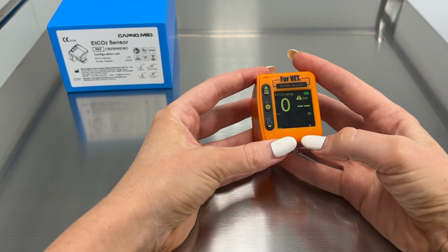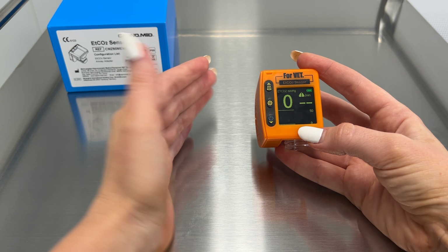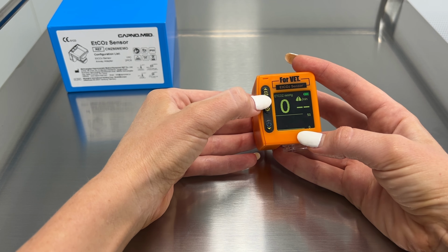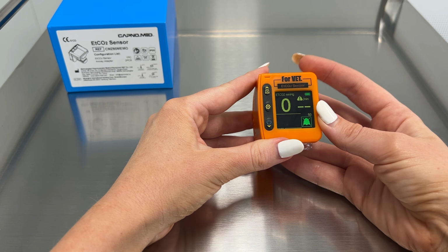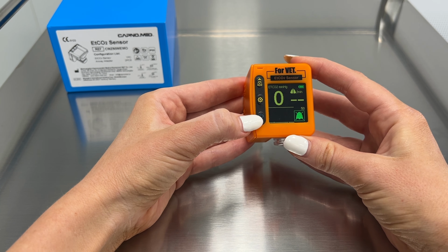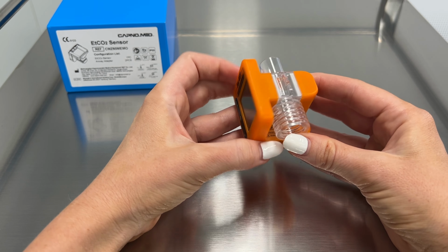If your alarm on this machine is going off and you just wanted to pause the alarm while you organize and try and correct the anesthetic, you would just press this alarm off button. It will just pause the sound for a little while. If we wanted to turn the machine off, I'm going to use this blue button to turn it off. Hold it down. You'll hear the beep and that's when it will shut down.